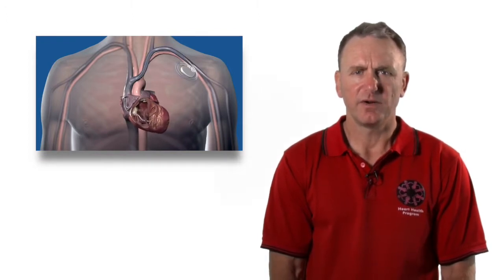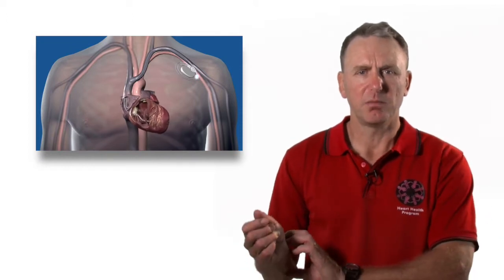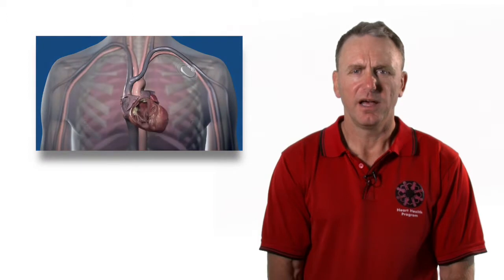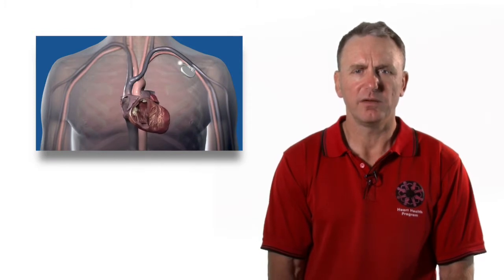It then has a very clever computer in it which will watch your heartbeat. It'll watch your heartbeat each time your heart is beating, and you'll know your heart is beating because we checked our pulse. If your heart decides to have a little bit of a rest, then the computer inside that little pacemaker will fire off and help your heart beat naturally. If your heart then starts beating naturally after it's fired off, then it just carries on watching and waiting for the time when your heart has a little bit of a holiday again.